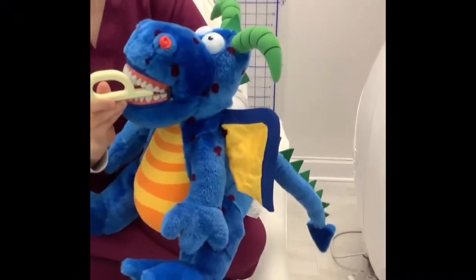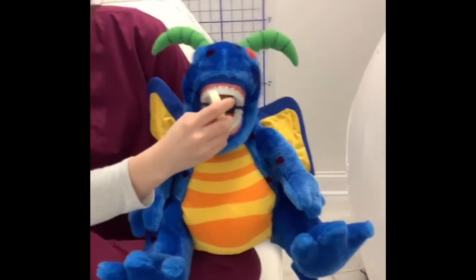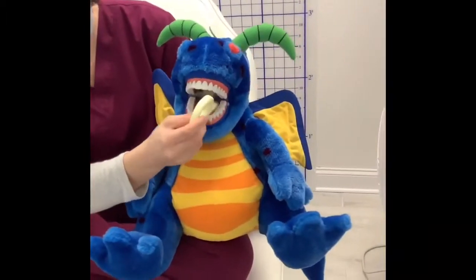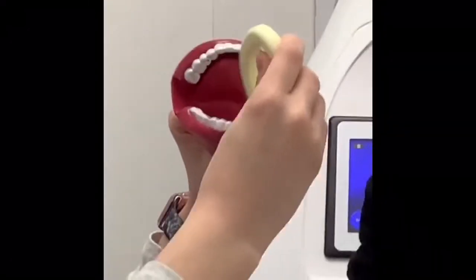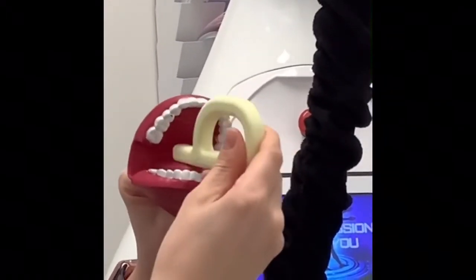The Grabber provides children and infants with an opportunity to explore their mouths, specifically the lips, tongue, and jaw. The Grabber is beneficial for improving jaw stability and control, which helps the mouth open wide enough to eat certain foods or produce certain speech sounds.